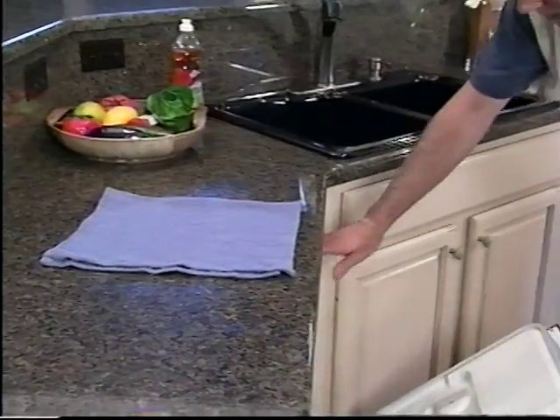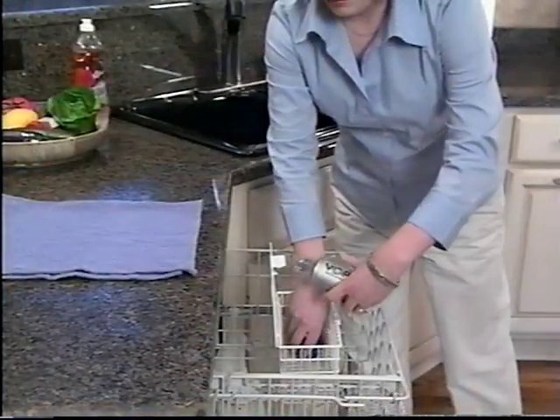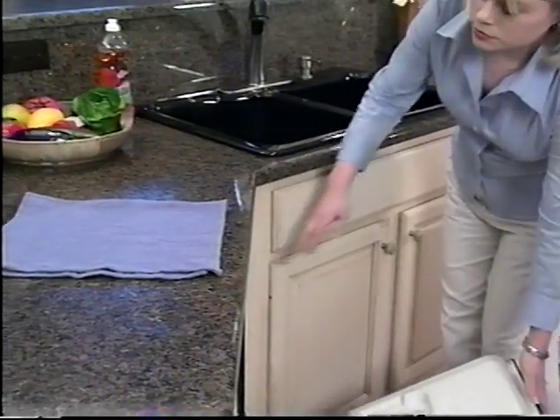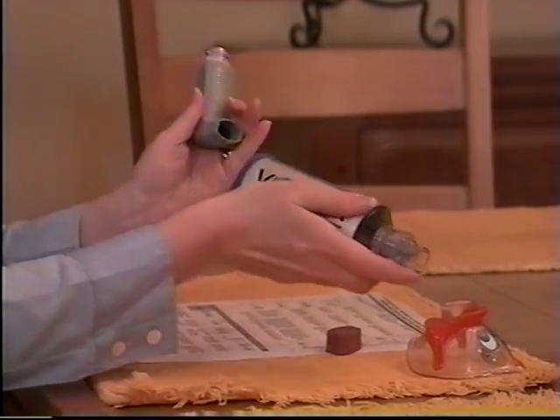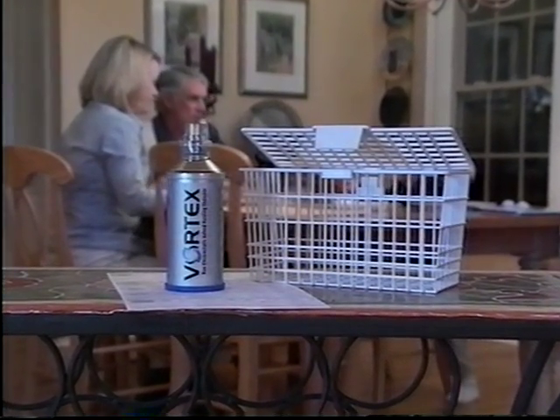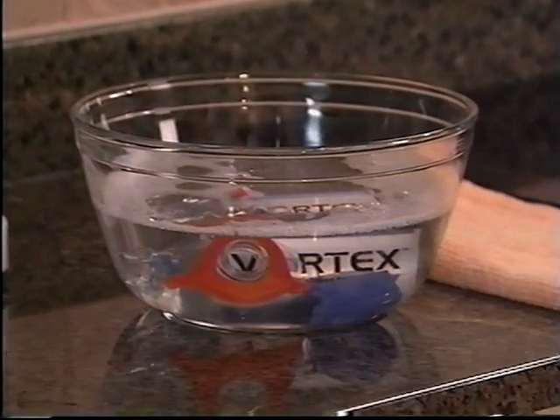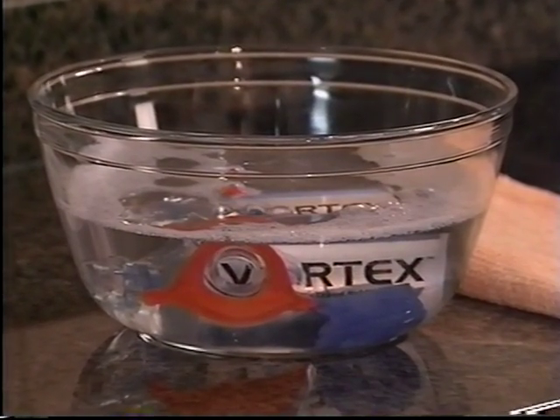Cleaning options include using a dishwasher or washing by hand. When using the convenience of a dishwasher, simply place the VORTEX in the top shelf after disassembling the inhaler, receptacle, and mask. Accessory baskets for washing small items, such as baby bottle parts, are useful to keep all the parts together in the dishwasher. Please note that the children's mask should only be washed by hand.